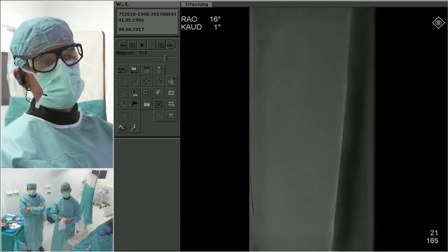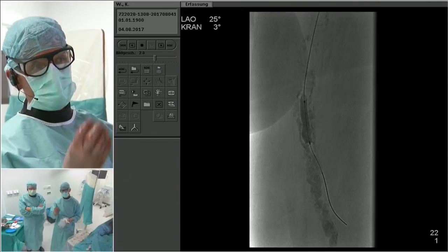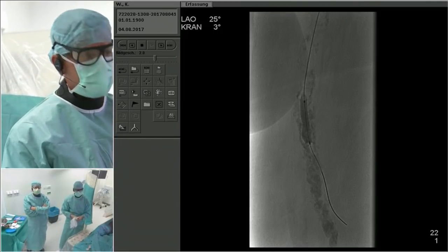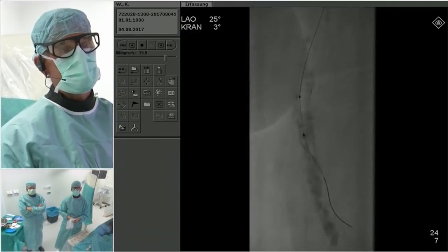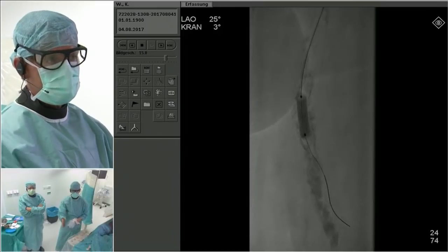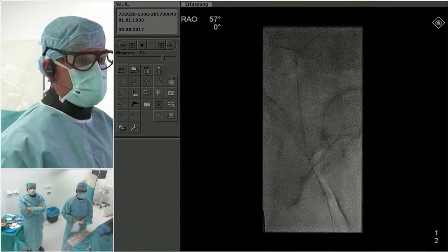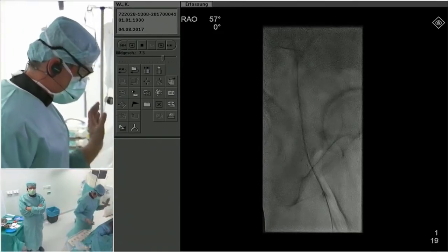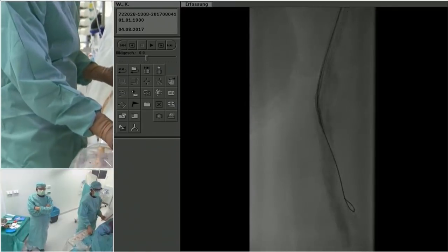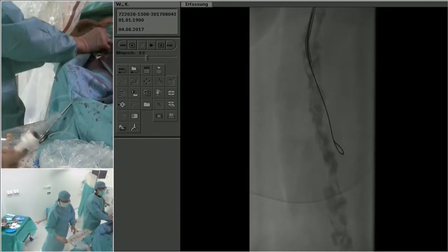And this here is a 320 coronary balloon, which eventually helped us open up that first part to the origin of the collateral, so that we can now have a catheter in, which gives us more stability to somehow get access into the occlusion. Well, it turned out to be a little more complex than we thought. Starting already with these kinds of problems is hard. Let's see.